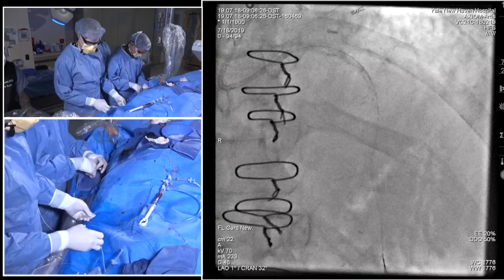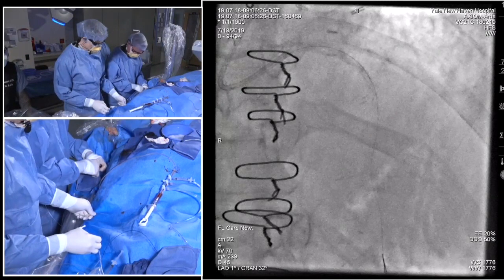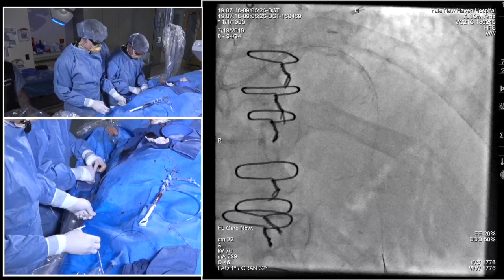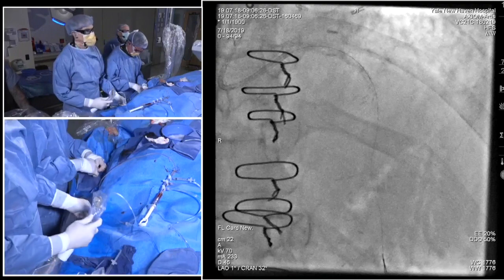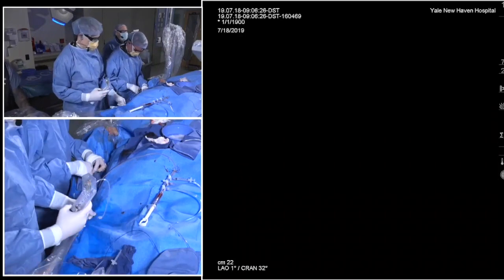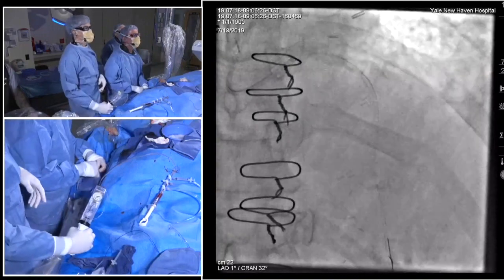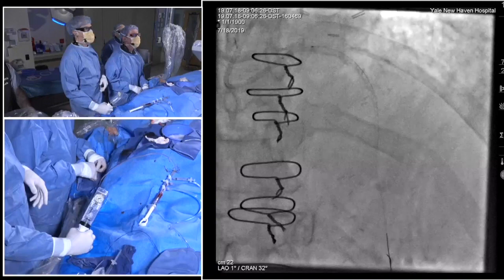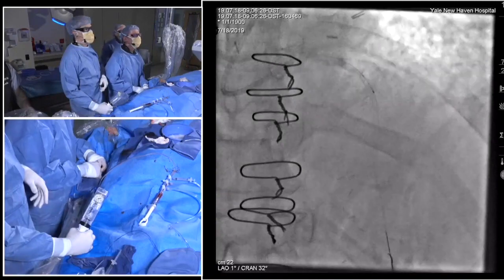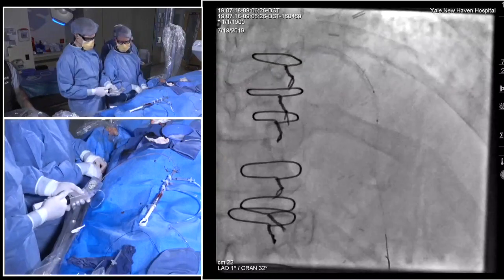Okay. So we're just putting down the balloon, and I think this will clear up shortly, and then we'll be able to image it and work on our stenting. Fluoro, please. What wire do you have down the LAD? This is now a workhorse wire. We just switched out from the rotofloppy wire. Got it. It's a Samurai wire.